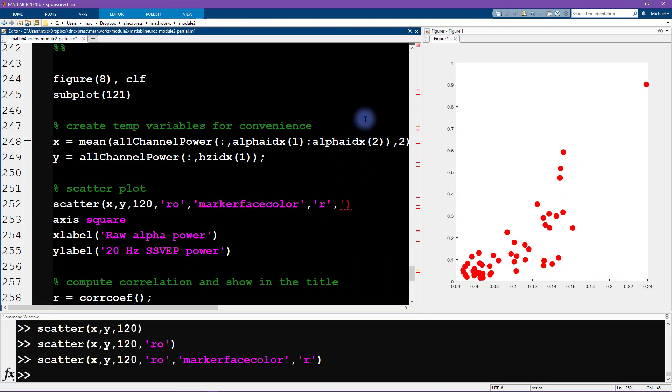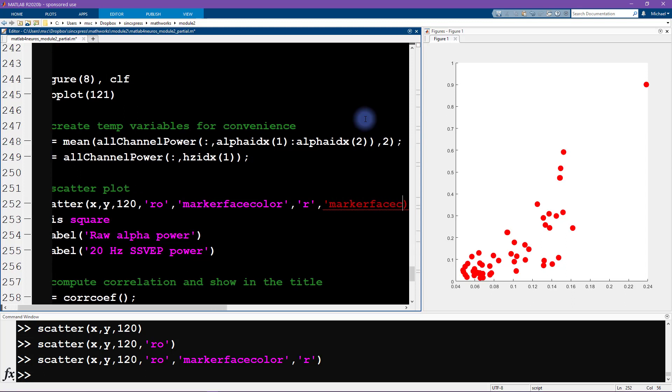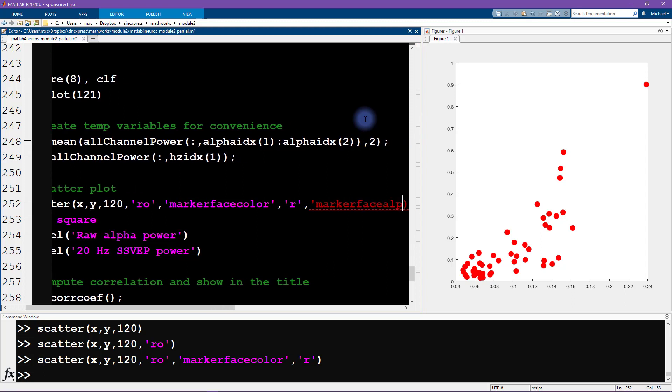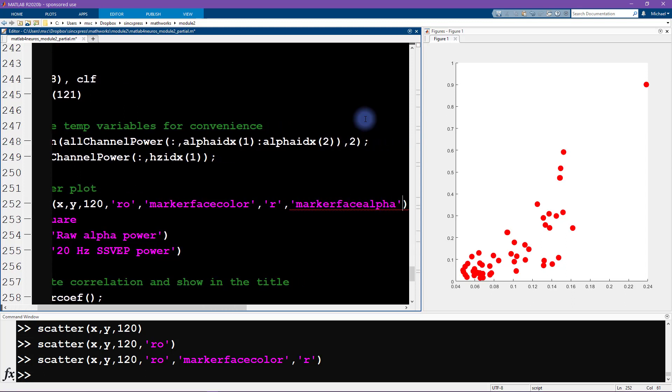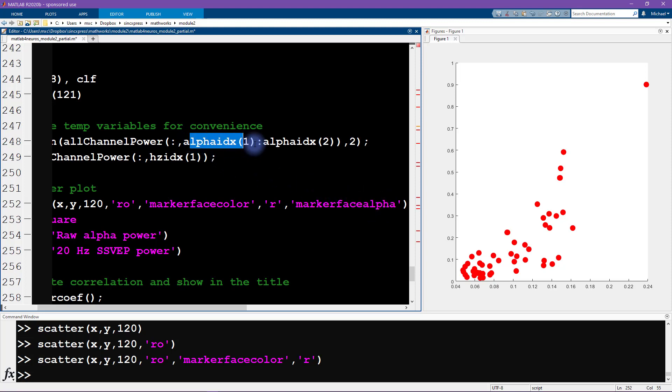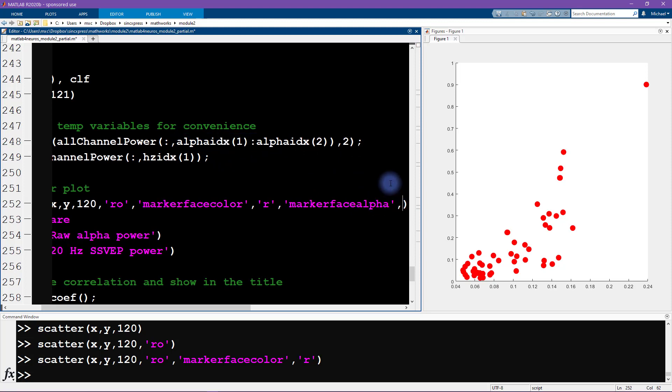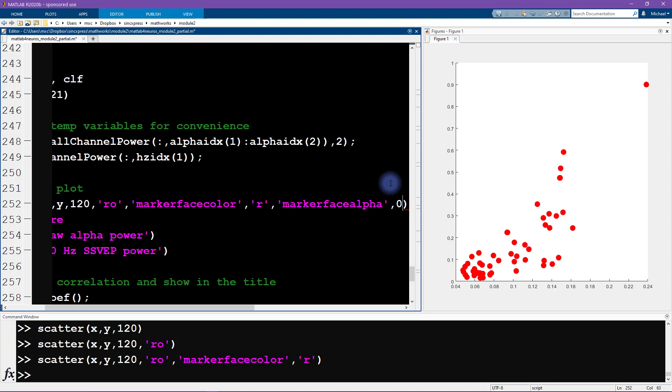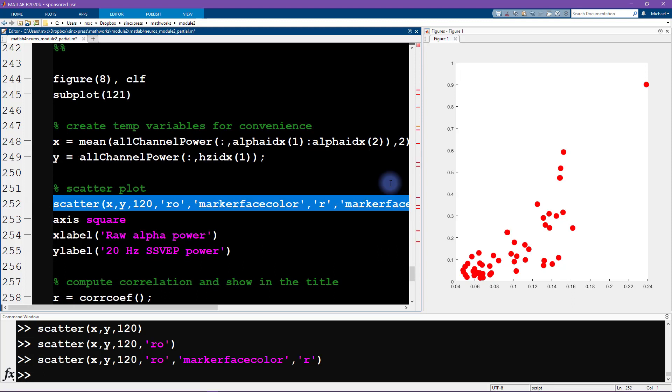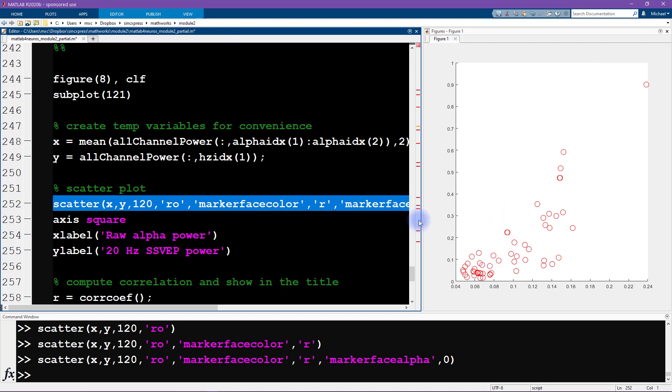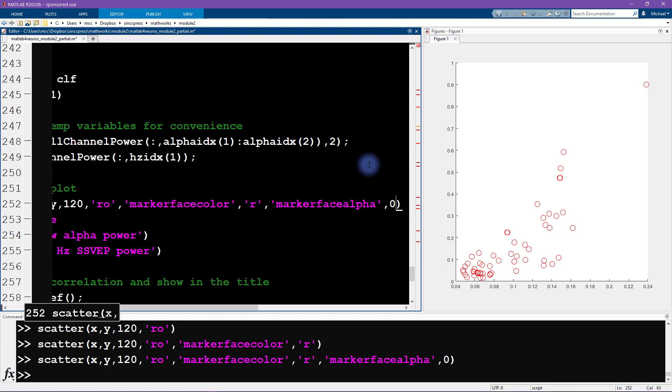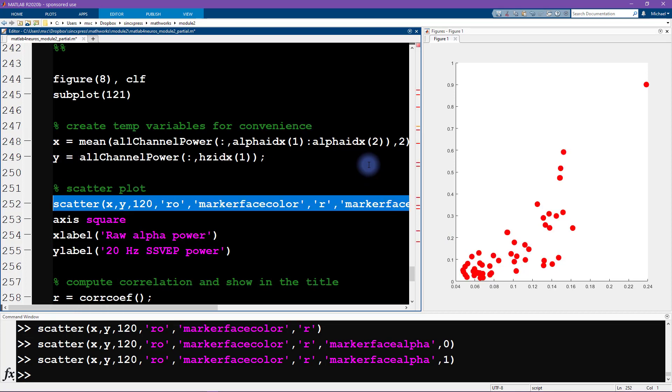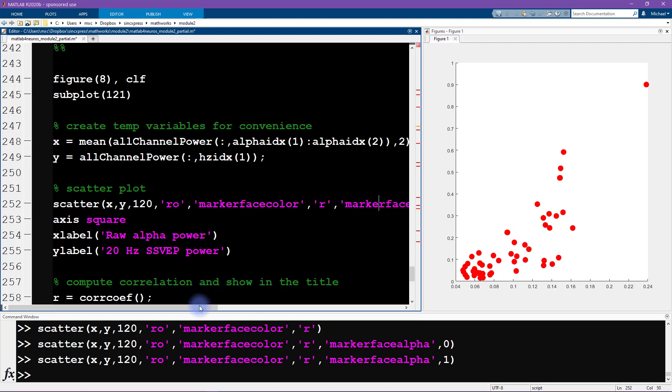I showed some partial transparency in here. It turns out that the transparency of the marker face is given by the property that is called marker face alpha. Whenever you're doing image processing and you see something about alpha, that's telling you about the transparency. A little confusing of course because we're working with alpha oscillations, but this is alpha for transparency. Alpha is a parameter that varies between zero and one.